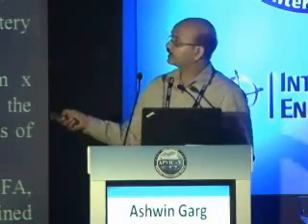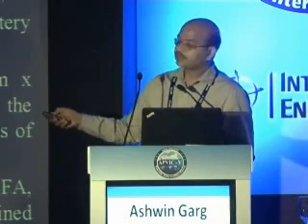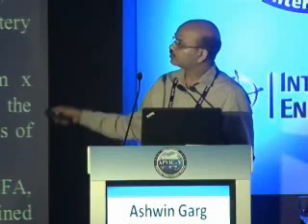So this is the picture which is post-mechanical thrombectomy. You can see the clots were removed in the superficial femoral artery. Now it is clearly showing the stenosis in the mid part of the superficial femoral artery. So thereafter, balloon angioplasty was performed. Now this is post-balloon angioplasty showing good caliber. However, the balloon angioplasty did not work in the distal part of the popliteal artery.